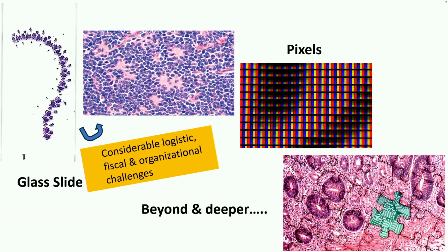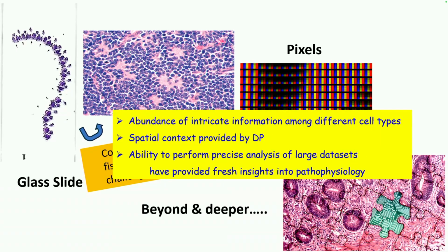When we provide a diagnosis on the basis of microscopy, we are giving superficial information to the oncologist about the grade and whether there are certain adverse features. But there is a lot hidden beneath, much deeper, subvisual information, and that is abundant.